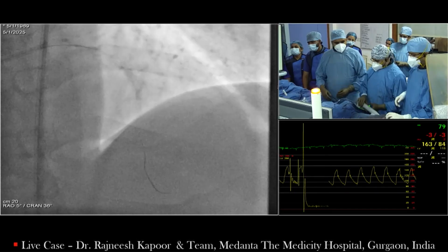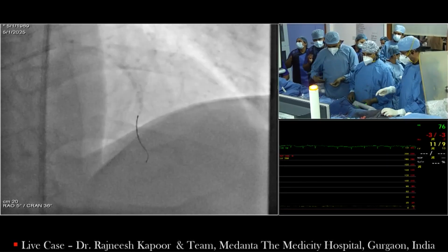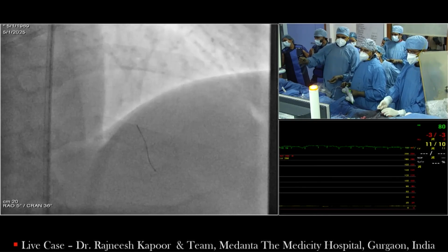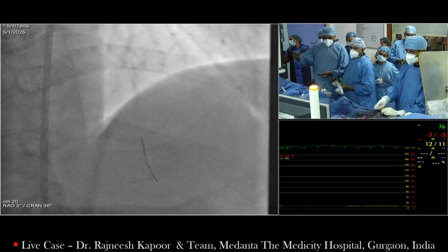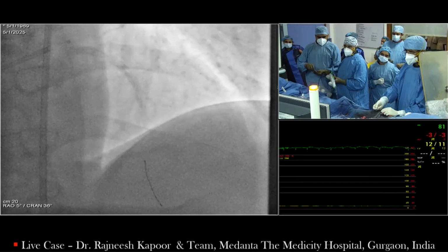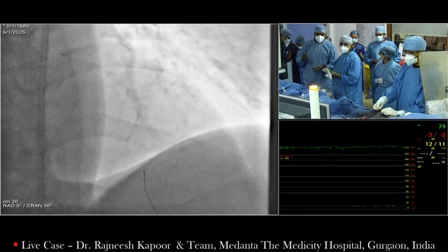So, Peter, I think your question is very good. I don't do PCI without CT surgery on site, and I do not think that you're supposed to be doing this, but I don't think there is any regulation that precludes these types of procedures at sites that do not have a surgical backup. But our guidelines say we shouldn't be doing rotational atherectomy without on-site surgery, so we don't have rotational atherectomy in all those places. My question is, should we change those guidelines? Because how often is on-site surgery really making a difference for rotational atherectomy? To me, it doesn't make sense.